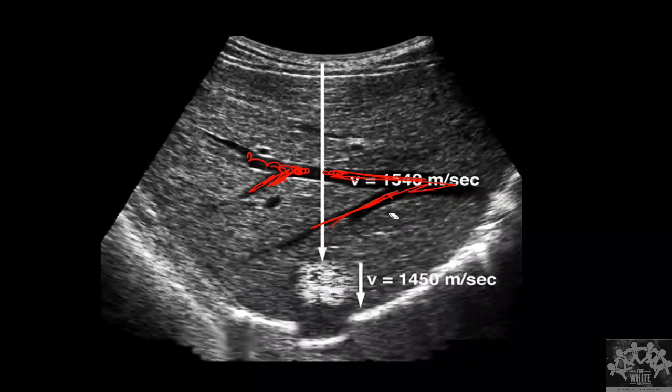It can be a vessel, but can it be only a vessel? Can it be a bile duct, a dilated bile duct? Exactly, that's a good question. Why not a bile duct? If I am not used to seeing an ultrasound image, I may not be able to tell. It may be a bile duct, it may be a vein, it may be an artery.